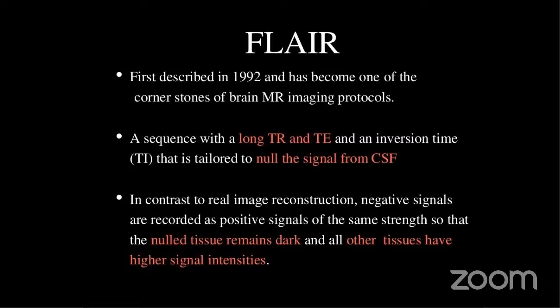First described in 1992, it has become one of the cornerstones of brain MR imaging protocols today. It is a sequence with a long TR and TE and an inversion time that is tailored to nullify the signal from the CSF. So what do you understand by this? It's T2, you're just nullifying the CSF signals, right?